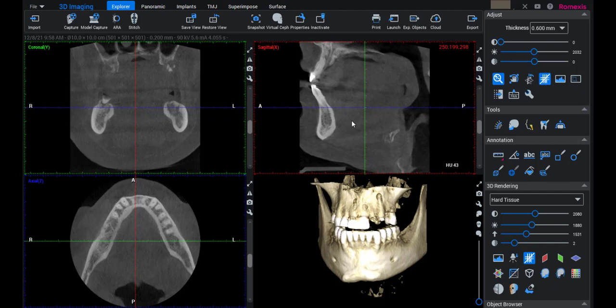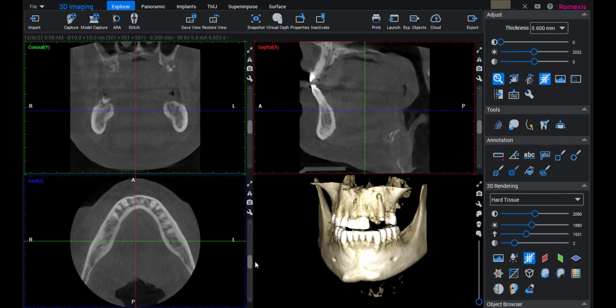This video shows how we use Romexis when we're evaluating a single tooth problem, or how to isolate a tooth. When we scroll through the axial view, you can see there are multiple problems.